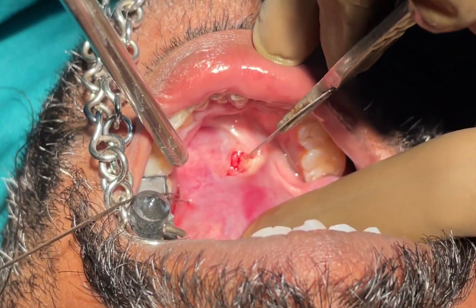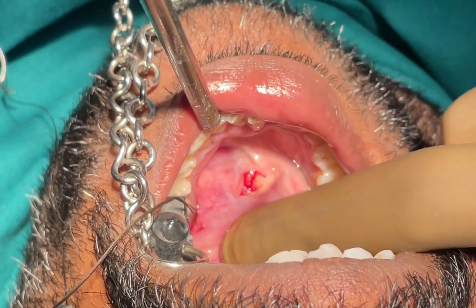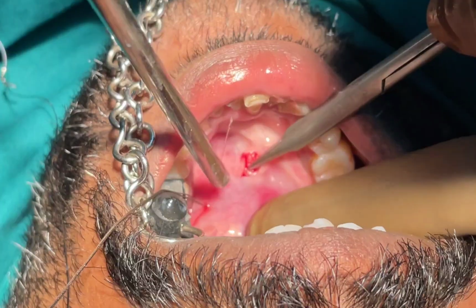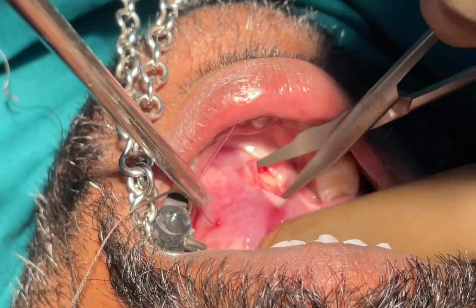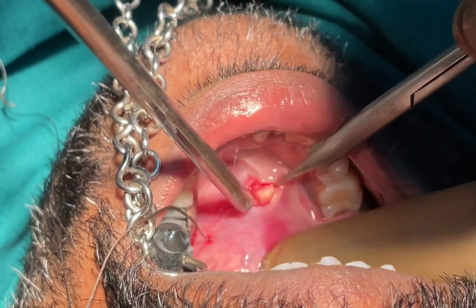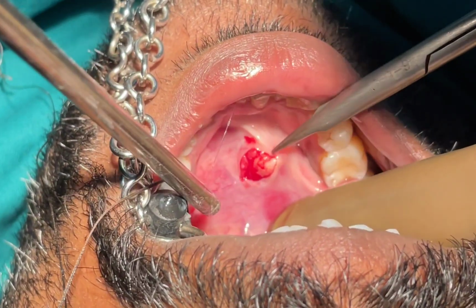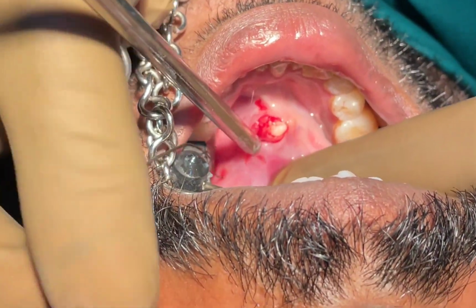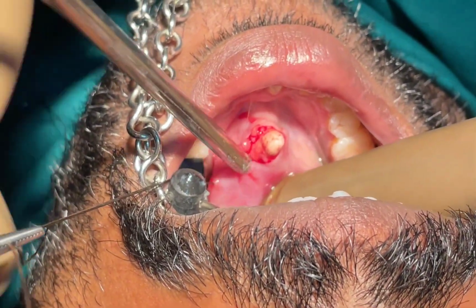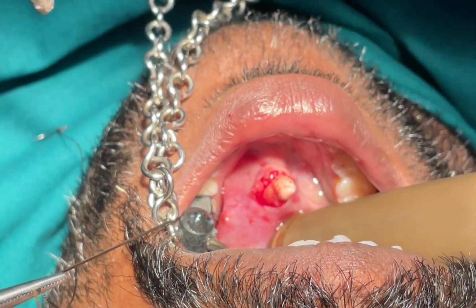A bilateral lingual nerve block can be given and the floor of the mouth can be infiltrated, and you can palpate the hard swelling over the floor of the mouth, and you can place an incision over that hard swelling with a 15 blade. Before placing the incision, remember to get a stay suture. A stay suture is held posterior to the hard swelling so that the stone doesn't slip posteriorly.